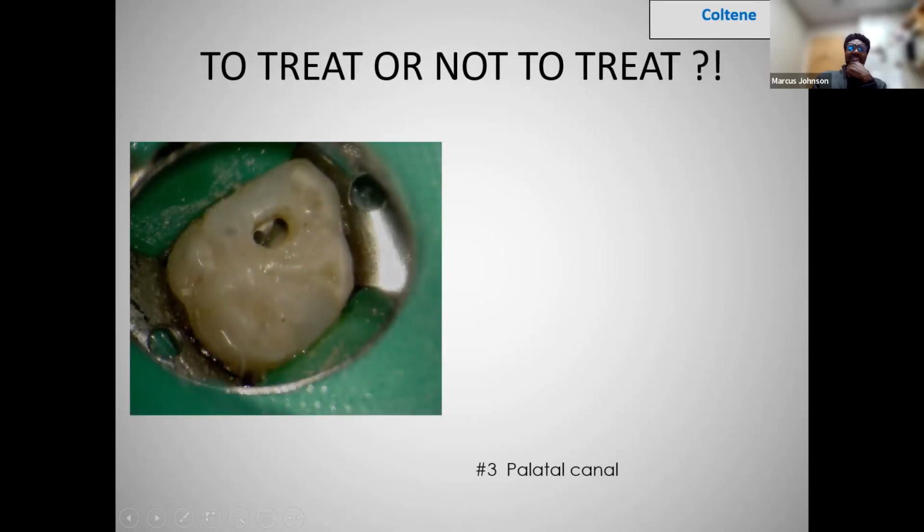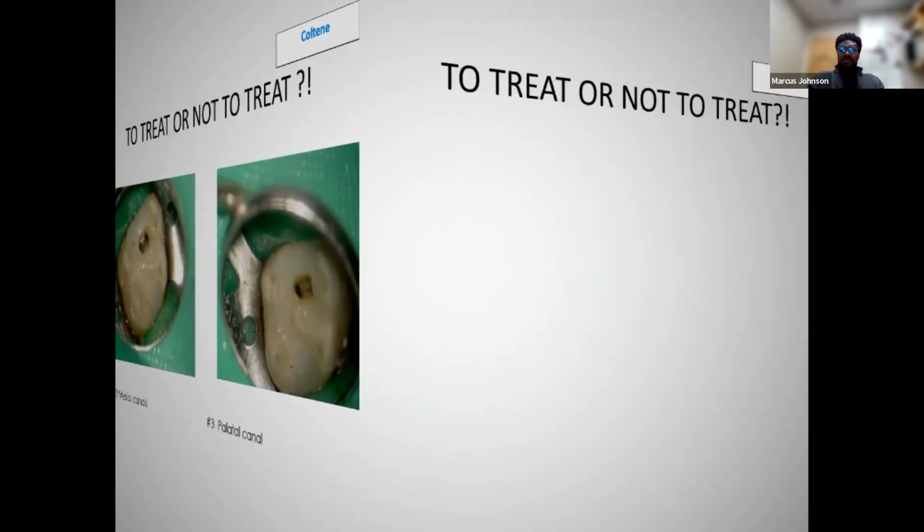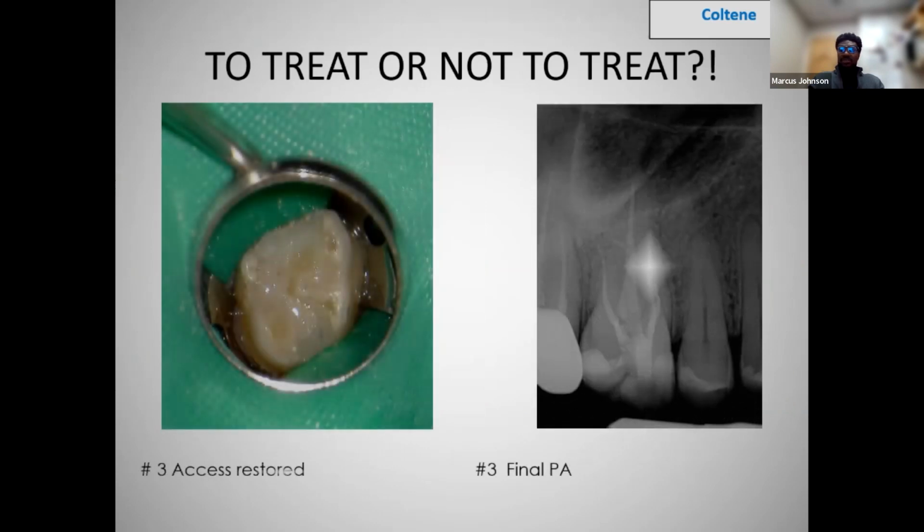Again, minimally invasive endodontics is not necessarily saying what's the smallest access I can make. It's just stating, where can I respect dentin? I was in a good mood. I felt comfortable. I created a very small access, but I thought I was still able to negotiate into my canals. And so, yeah, went ahead and was able to obturate that case. And I need to follow up on that, but I haven't heard back from him, so hopefully that's a good thing.